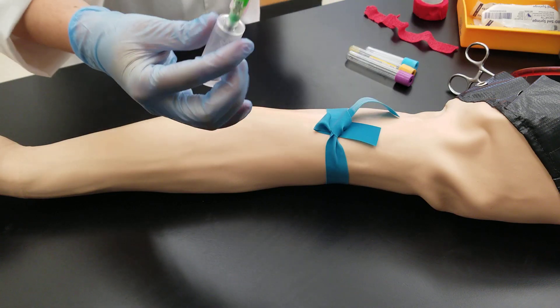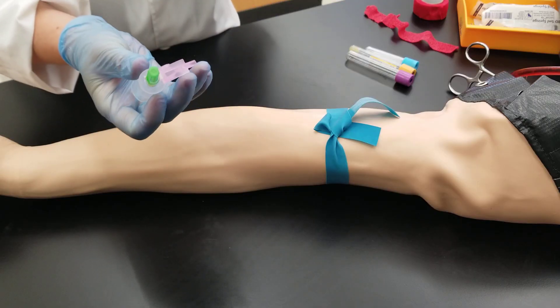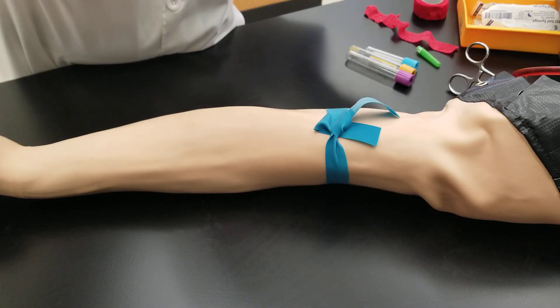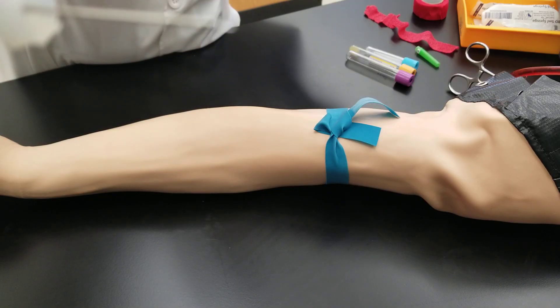I have put my needle in the hub. Now I'm going to put the safety back and I'm going to remove the cap. Here is the bevel that I was talking about.